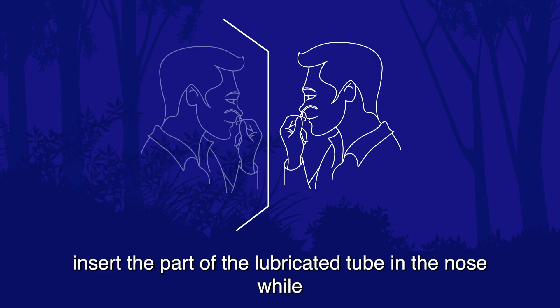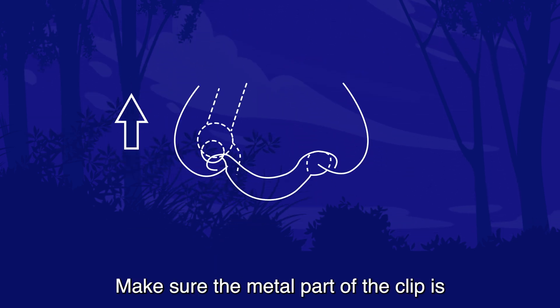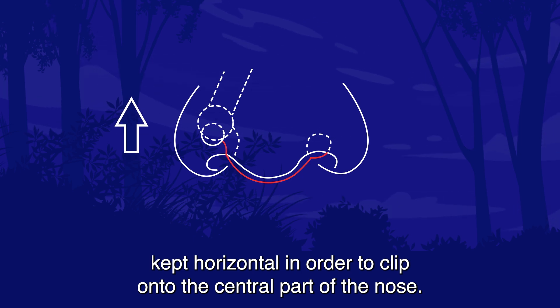In front of a mirror, insert the lubricated part of the tube in the nose while continuing to breathe normally. Make sure the metal part of the clip is kept horizontal in order to clip onto the central part of the nose.